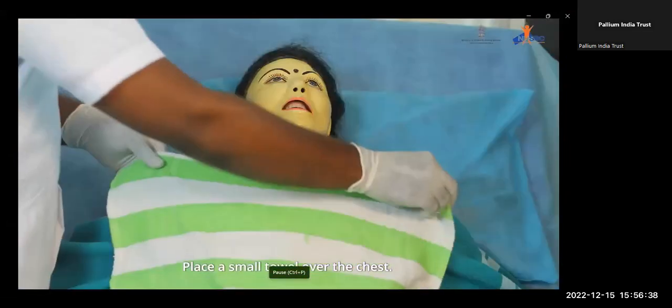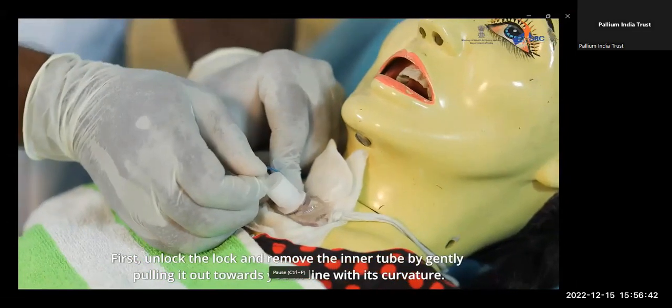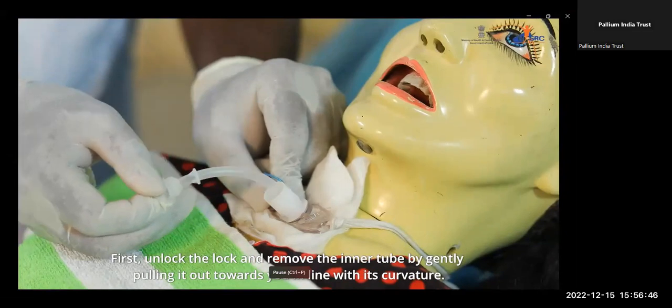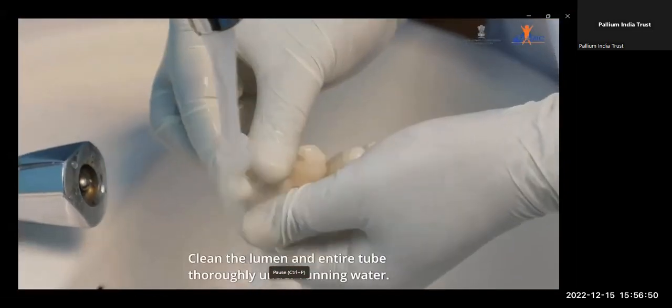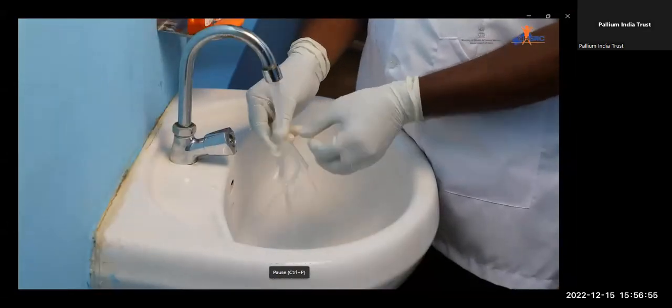Place a small towel over the chest. First, unlock the lock and remove the inner tube by gently pulling it out towards you in line with its curvature. Then, wash the inner tube. Clean the lumen and entire tube thoroughly under running water.